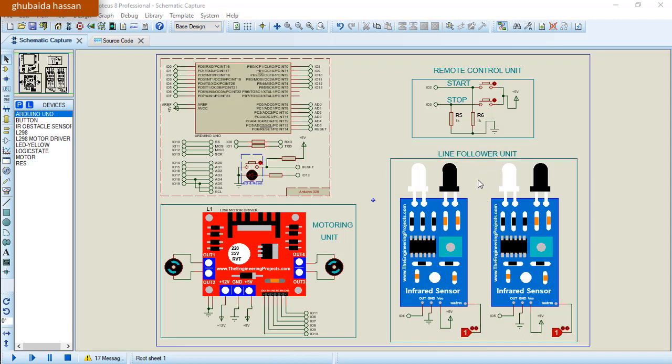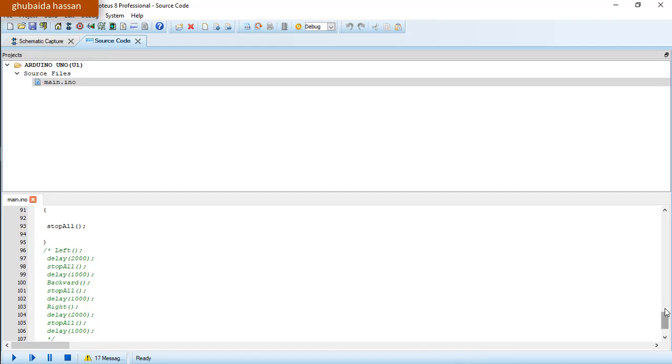So normally we will draw the black color with white colors on either side. So we will have to make sure that the IR modules always produce some amount of voltage to our microcontroller. Okay, and up here is our remote control unit. We'll have the start button and stop button. This version of Proteus helps us to write the code on it, so it's pretty awesome.